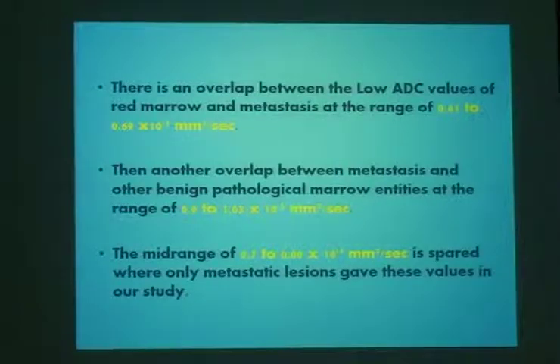What I concluded from my study is that the addition of diffusion-weighted images played a major role in the detection of more lesions that were less conspicuous on the other conventional MR images, and were furthermore not distinct on the bone scan. Yet, there is another issue, which is the demographics.